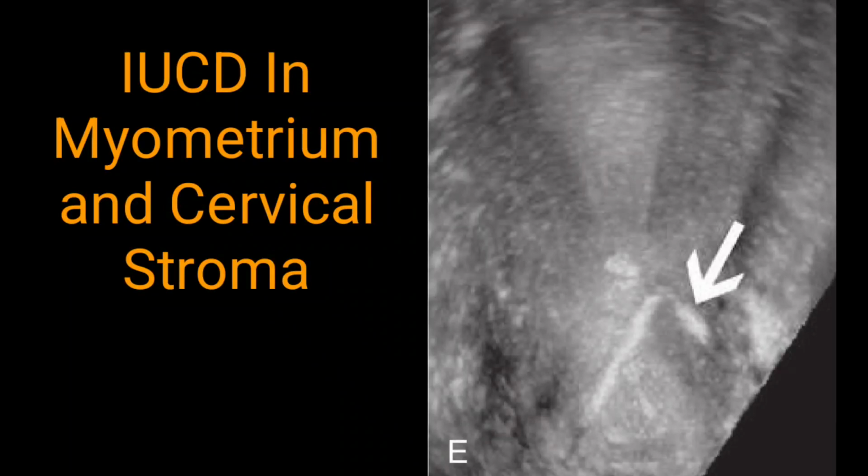In this image, the upper uterine endometrial cavity is clearly visible. You can take the endometrial thickening as well. As far as the IUCD is concerned, this is a copper T, and both arms can be easily seen. Both arms are embedded in the stroma of the lower myometrium and in the cervical region. So this is likely to expel out. It needs further attention, because the function of the IUCD, so far as the copper T is concerned, is for contraception purpose. So this purpose is no longer maintained.